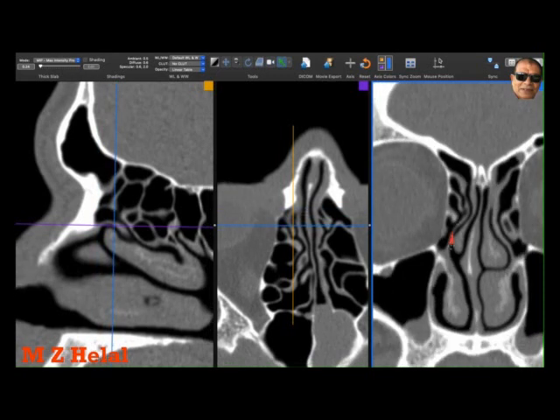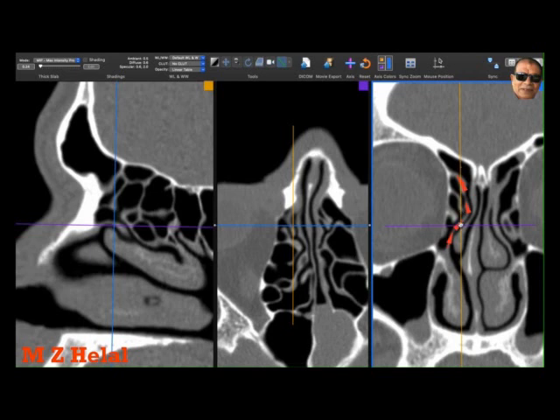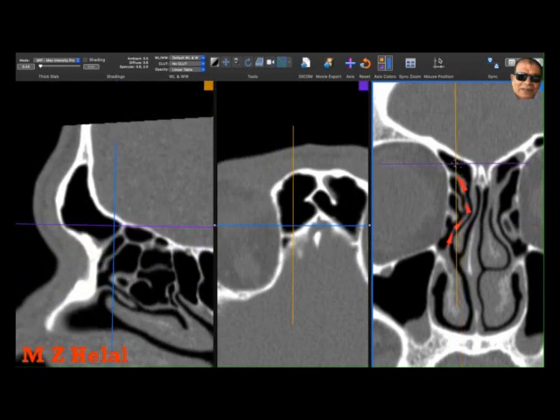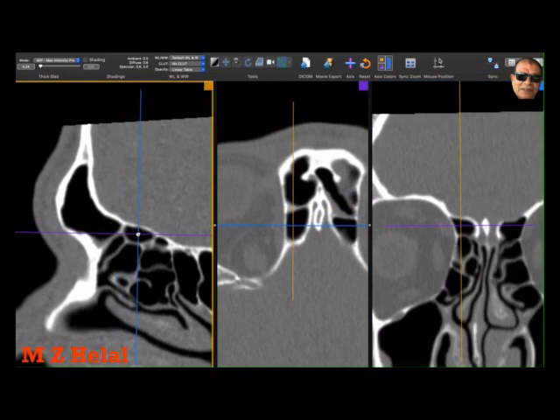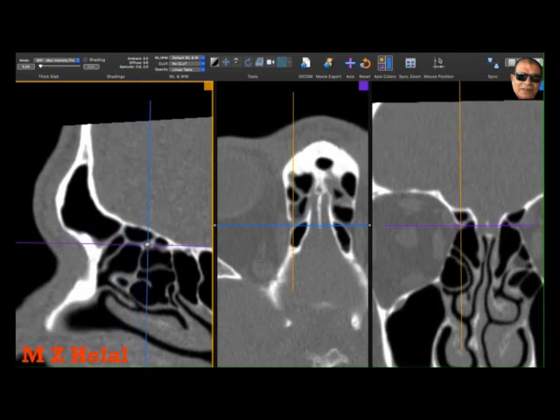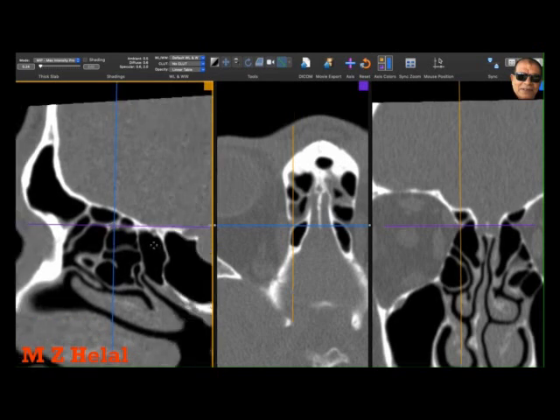As we said, the uncinate is important because if you follow the uncinate process up like that, you will go to the frontal ostium — it is the uncinate. If you follow it up to near its attachment, here is the frontal sinus on the sagittal. There is also a supra-orbital cell here.